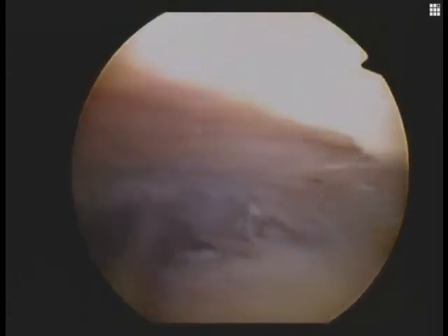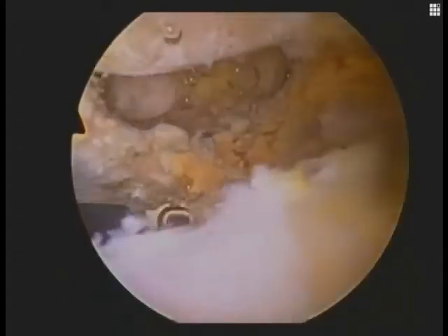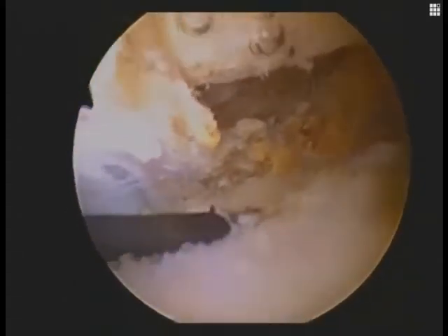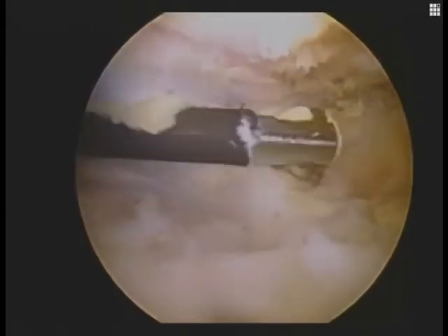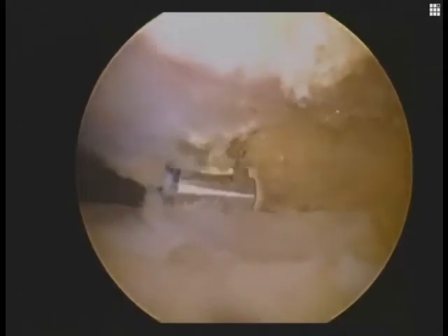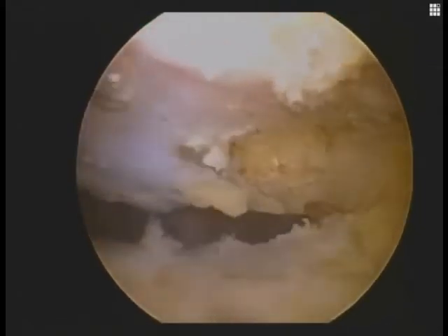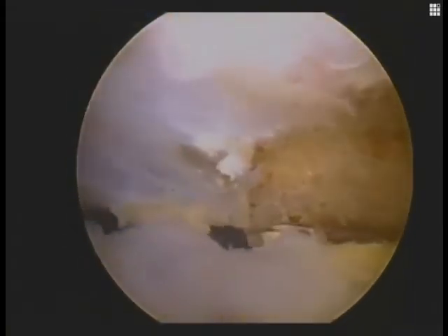We'll bring a spinal needle into our accessory anterolateral portal, followed by an ablation and resection device. We're abutting the end bluntly and then ablating the soft tissue off the concavity and lateral margin and tip of the coracoid. The CA ligament is seen intact above and again remains as our guide. We debride the tissue below and lateral to the tip of the coracoid to clear our space to eventually place our Arthrex GraftRope AC joint reconstruction guide underneath the base of the coracoid through the anterolateral portal.